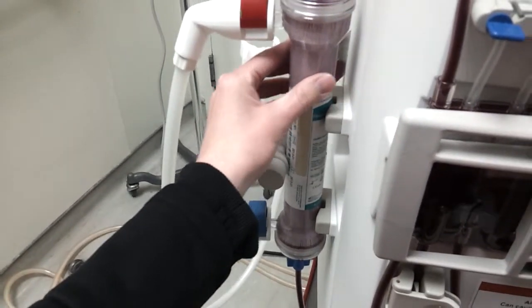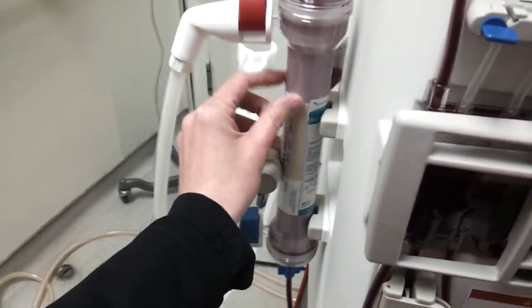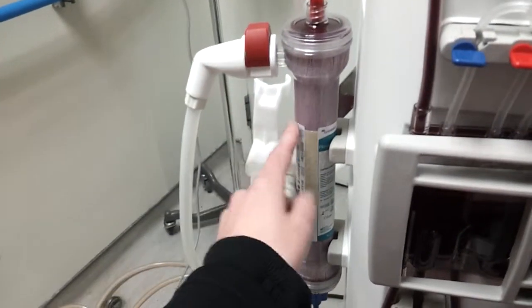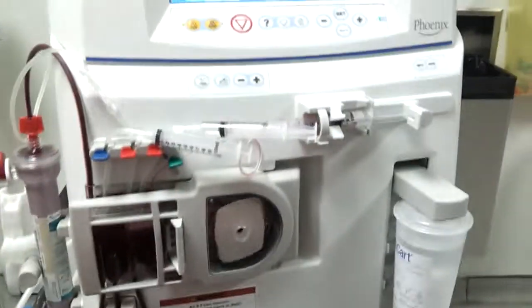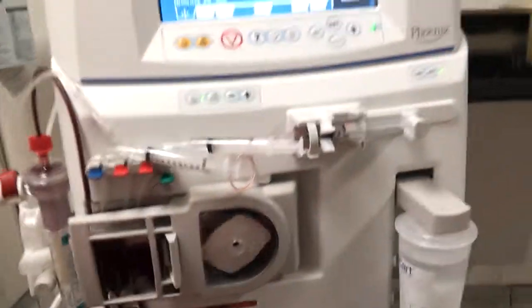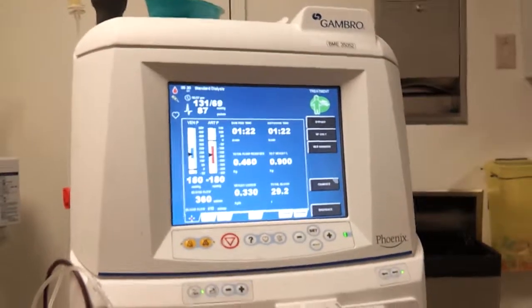But this one here is great because, if it wasn't for dialysis, I wouldn't be alive. So I definitely am grateful and appreciative for it. So the blood goes through this, it's actually called a dialyzer, and it filters out all the toxins, and it returns the blood back to the chamber, and then through this venous side here, it comes back into me. So you can see it's a pretty amazing technology. Like I said, if you can't live without your kidney function, this is what the alternative is. Thank God there's an option, which is to be on dialysis.